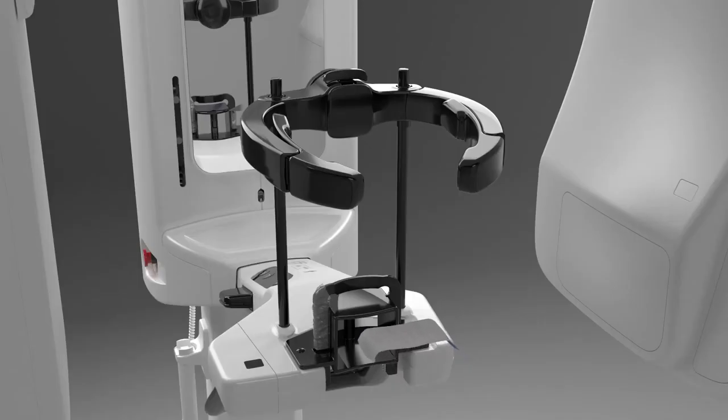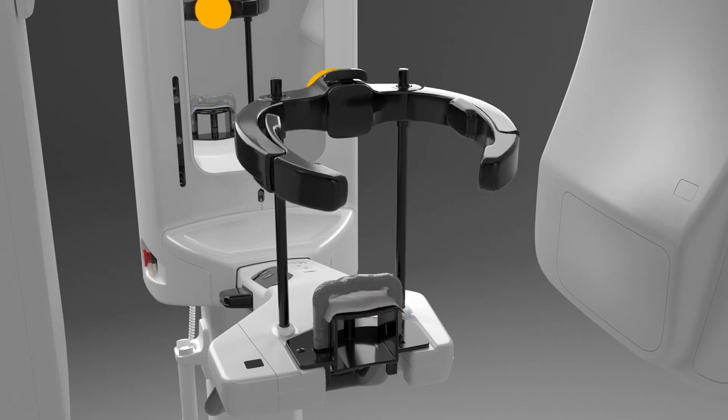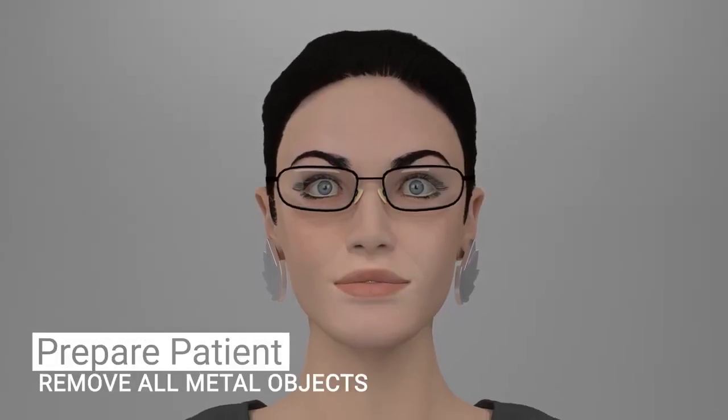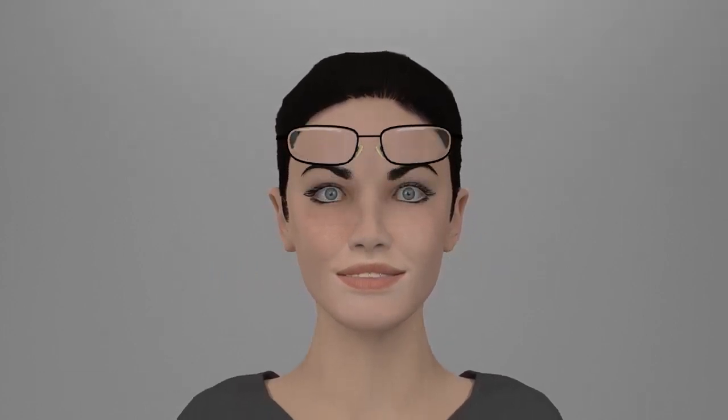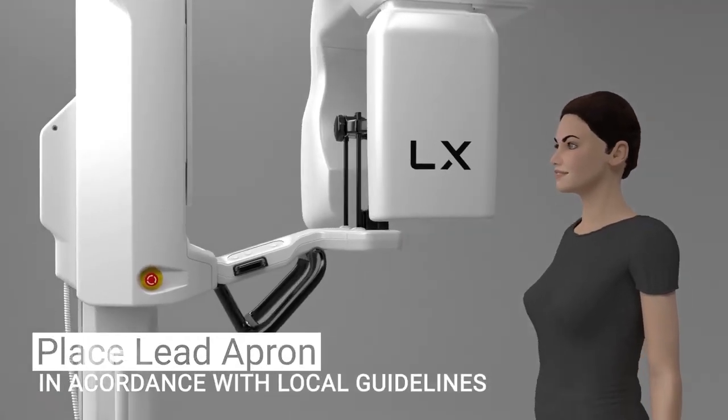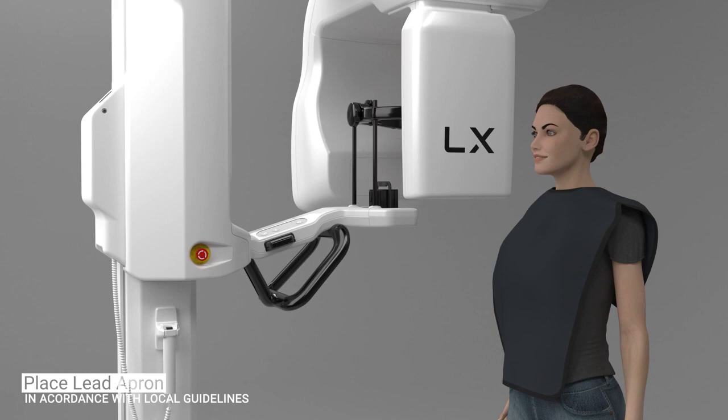Place disposable covers on the lip support and patient chin rest. Open the patient head support, turning the knob on the head support counterclockwise. Prepare the patient for the procedure by asking the patient to remove all metal objects, including earrings, necklaces, glasses, hairpins, and all removable appliances from above their shoulders. Properly place a protective lead apron over the patient in accordance with local regulations.